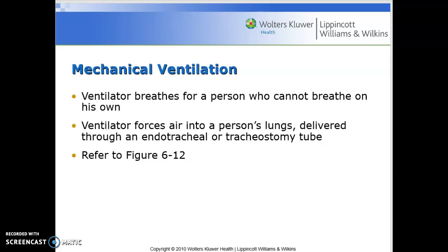Chapter 6, Video 3. Now we're going to talk about mechanical ventilation. This is a ventilator that breathes for a person who cannot breathe on their own. It forces air into a person's lungs, and it's delivered through an endotracheal or a tracheostomy tube.